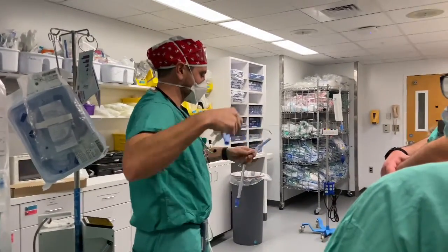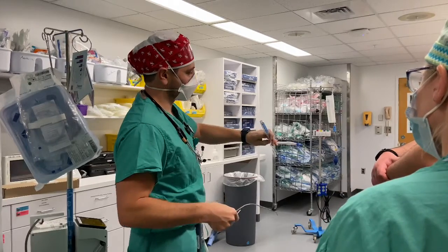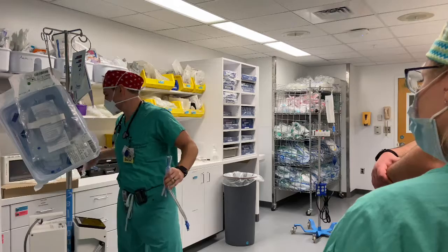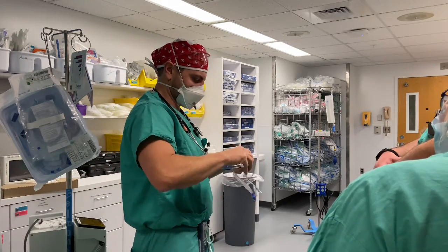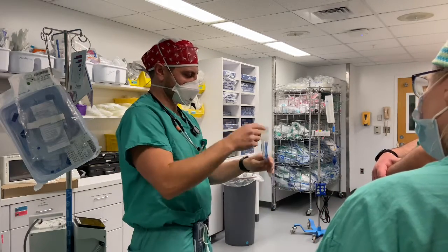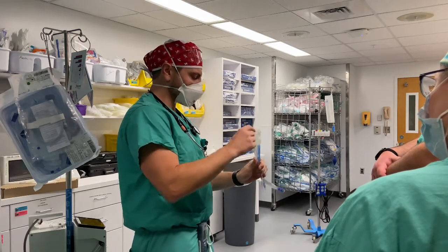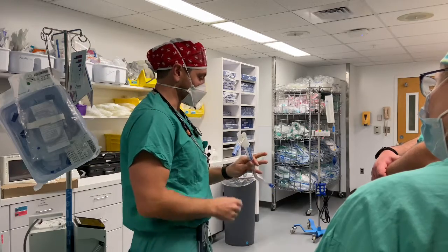So let's say we've placed this. We went in, put it through the vocal cords, rotate it over so it's sitting on the right side. This connector, doesn't matter which side you hook up either side to, goes on like that. Okay, so they're just sort of pushed on to these connectors here. So this is sitting in a patient, this is connected to your ventilator. Say we want to selectively ventilate the right side with a right-sided tube.